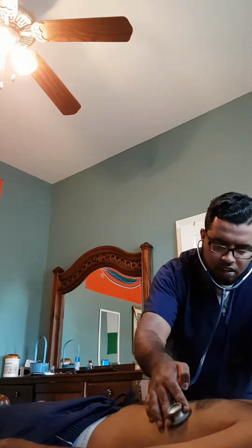And then I'm going to listen to his heart sounds here. Second intercostal space. I'm going to move from the right to the left, and I'm going to move my way down on his left side. Second intercostal space. Left side here, second intercostal space. I'm going to go down inch by inch. The third, the fourth, Erb's point, mitral valve area, and then I'm going to go down to the apex here, his apical pulse, which I'm going to get for 1 full minute.